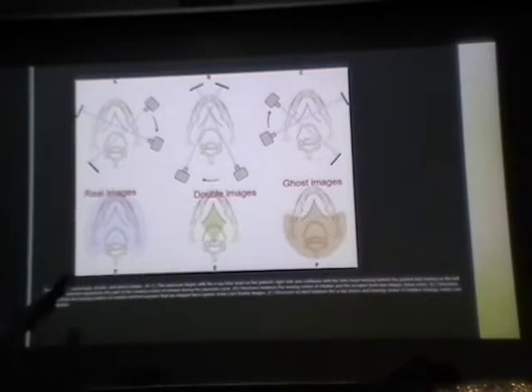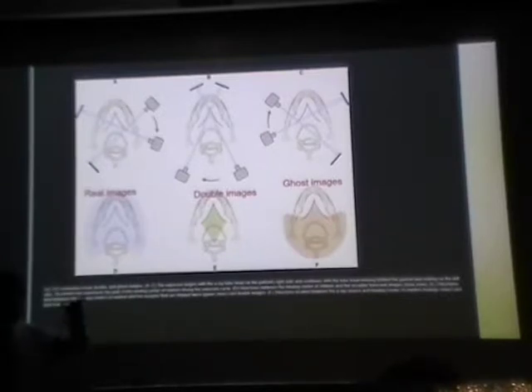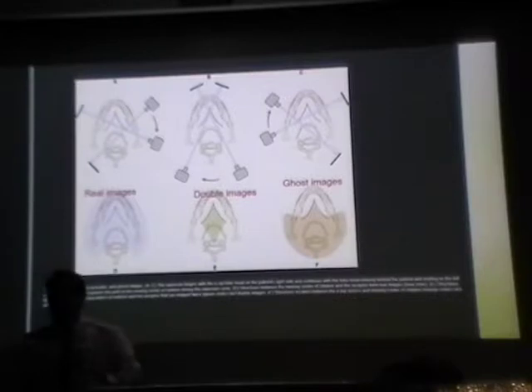So here, whatever the structures that are present, you're going to see as a double image. For example, cervical vertebrae, it is in the midline, right? So since cervical vertebrae, when the X-rays, like for the panoramic image, it goes and captures twice. So that's one of the reasons that you are going to see a double image, because it's in the midline region.